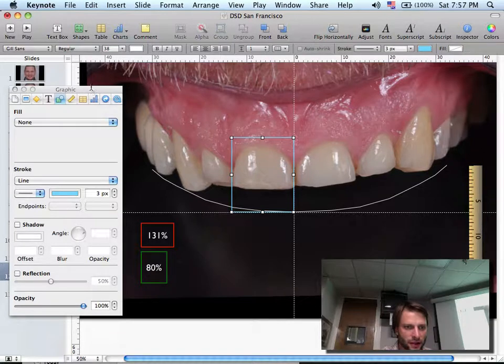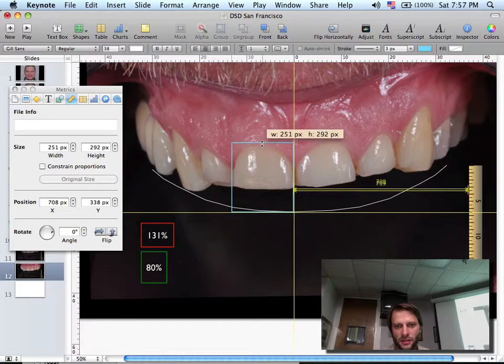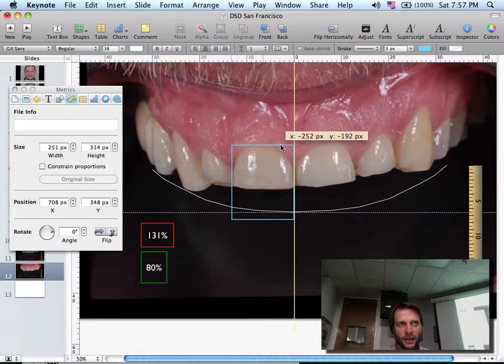So this is, let's adapt. I want to unblock the proportion so I can change this rectangle, and the main change is, let's not move his cervical. This is one option. What is the other option? Let's move everything down and make it even longer.